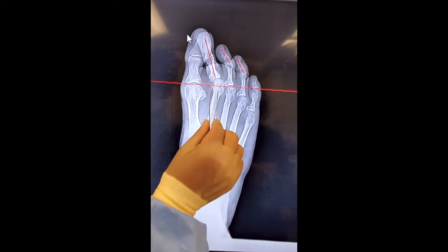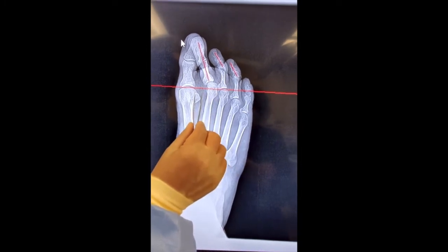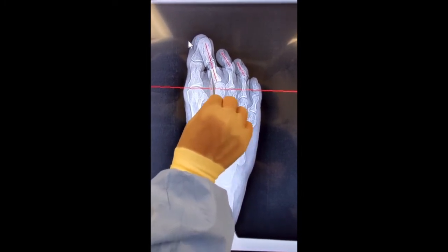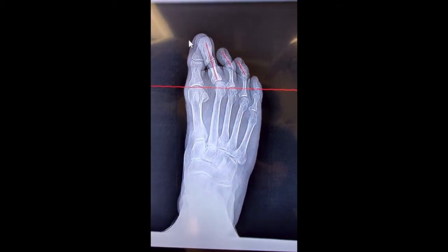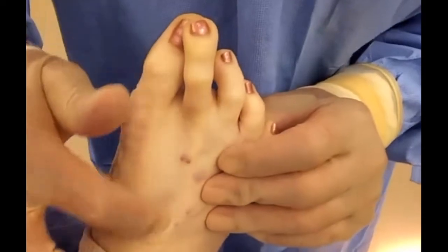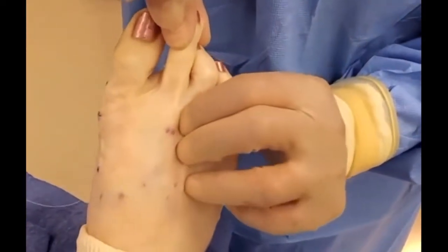Here's the x-ray. What we're doing is taking this bone and shifting it over to the left, shortening it a little bit as well, so that this hits that and moves the toe over to the right. We're going to do a Weil osteotomy, making an incision right there to get this toe down and over.